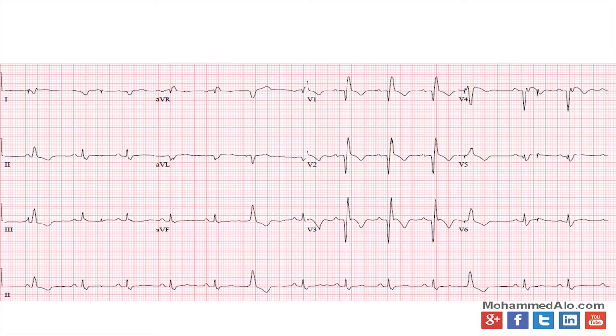The next one here, if you focus on V1, you've got that right bundle branch block, probably an old posterior MI. Tall R waves there. It could also mean RVH. That's always a possibility. There seems to be some kind of conduction abnormality or repolarization abnormality with the ST segments going down and the T waves being down. But that's probably all that is. Every QRS has a P in front of it, except for that PVC right around where V4 and V5 start. But otherwise, looks pretty normal.